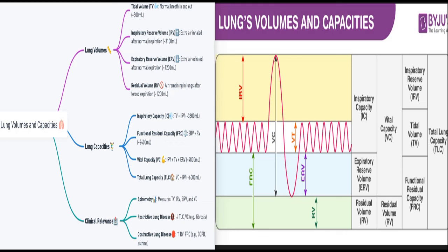When it comes to the flow loop in health and disease, know that in pulmonary obstruction, the second part of the respiratory loop is affected, and PEF is reduced. For restrictive disease, the forced vital capacity segments between total lung capacity and residual volume are reduced.